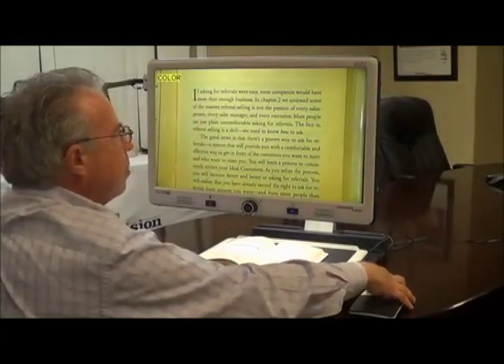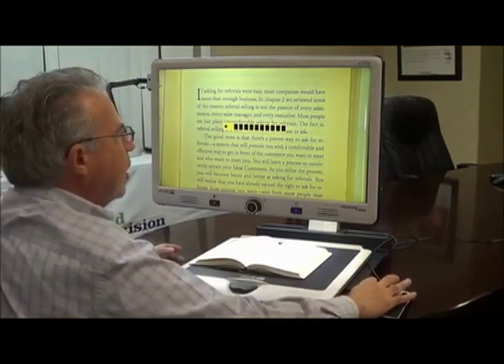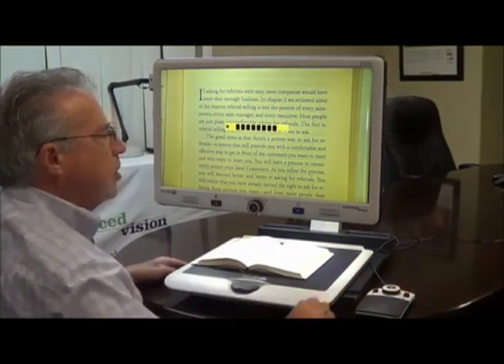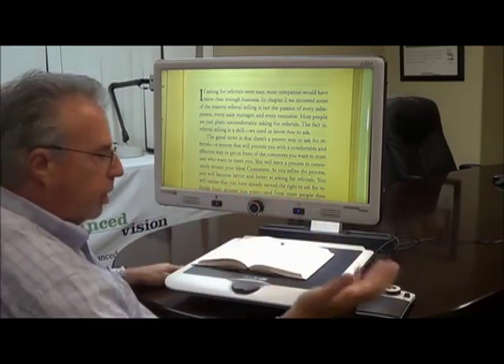I also have the capability to dynamically change the magnification and change the brightness — I can increase or decrease it. And it announces that as an aid to helping me with the process.